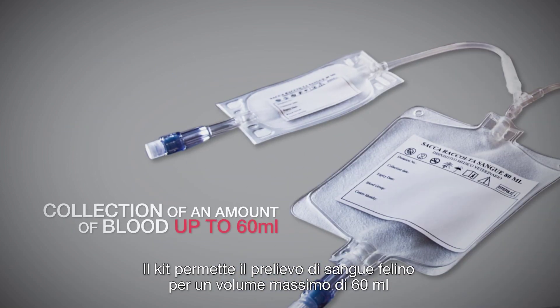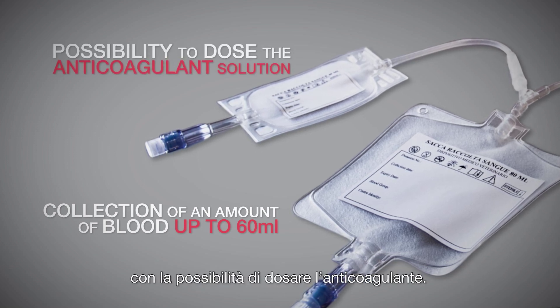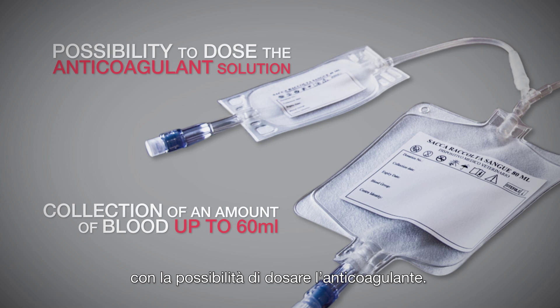The kit allows collection of an amount of blood up to 60 ml and gives the possibility to dose the anticoagulant solution in several stages.